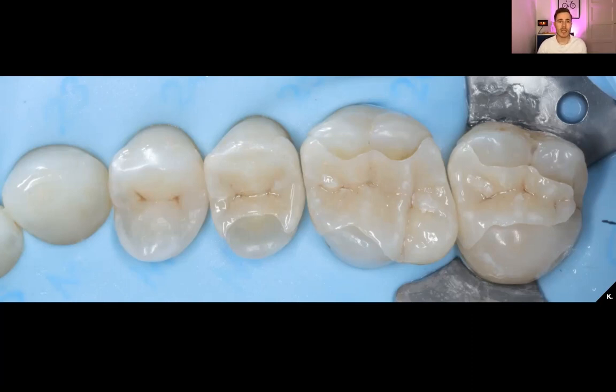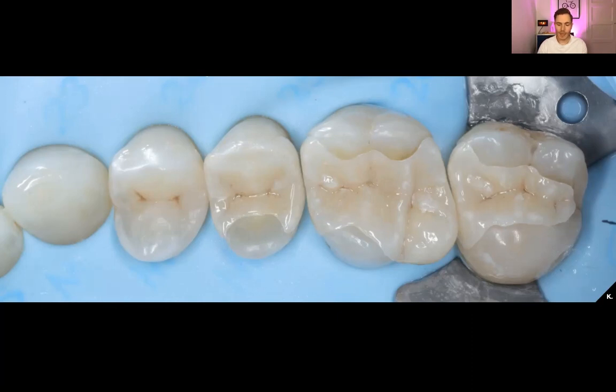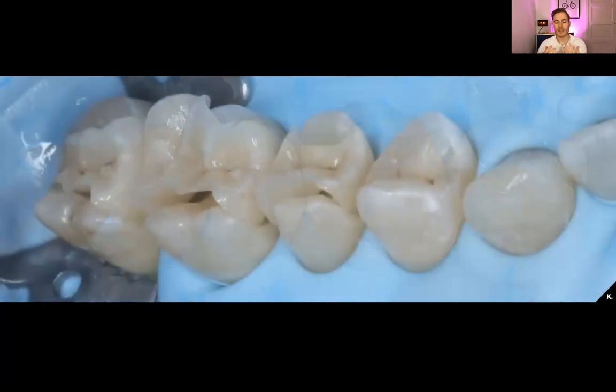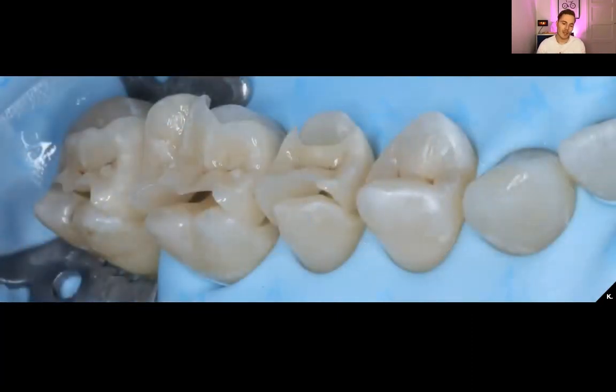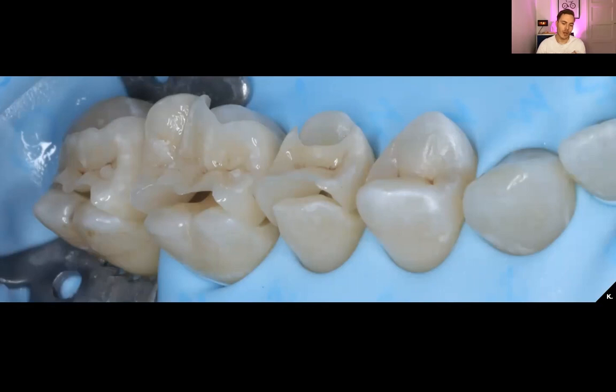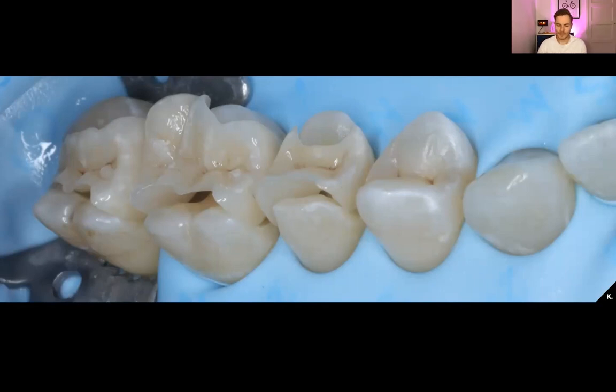Here I took some artistic photographs with the restorations half in place to show you what the restorations look like.